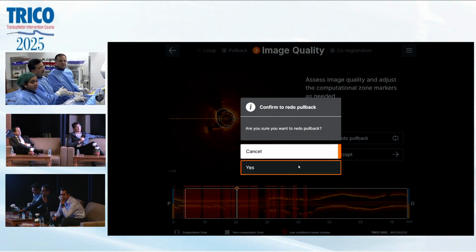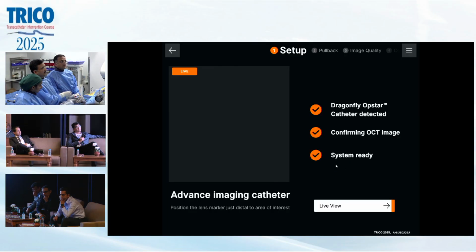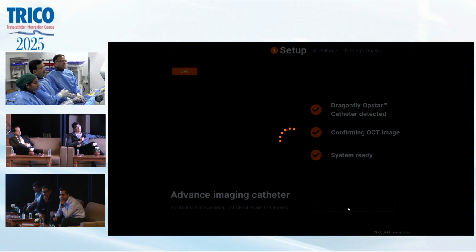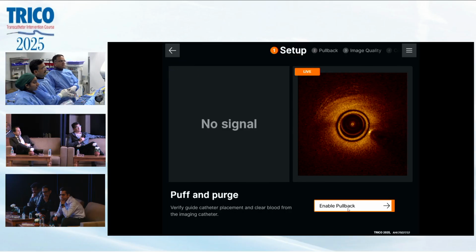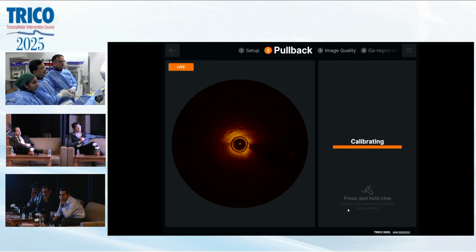Hold on. Move back a little bit. Pull back a little bit. Proceed. Okay. Just 1 second. Okay. Good. Another breathing. Good.